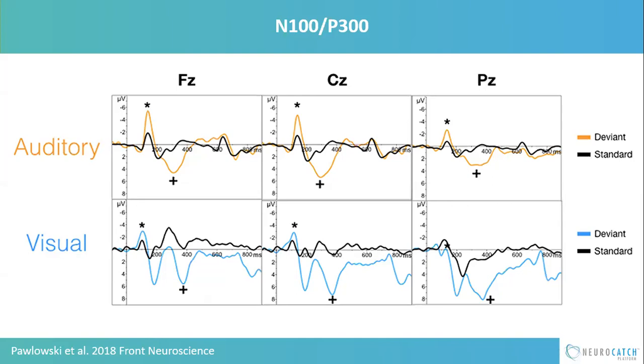So in an example where we would worry, do we have alpha as an artifact? That's the most common artifact that can happen, particularly if patients are sleepy. What would you do to look at any result to assess whether or not that was due to alpha versus a legitimate peak? I'm not going to make this a question and answer. I'll let you think about it, and while I'm talking, hopefully you come up with it.